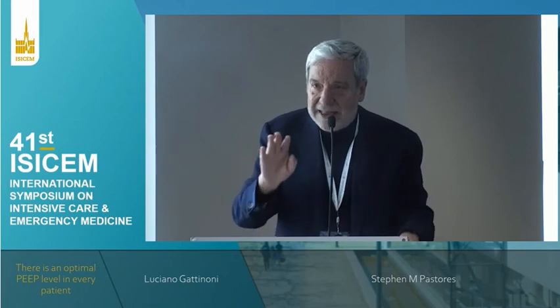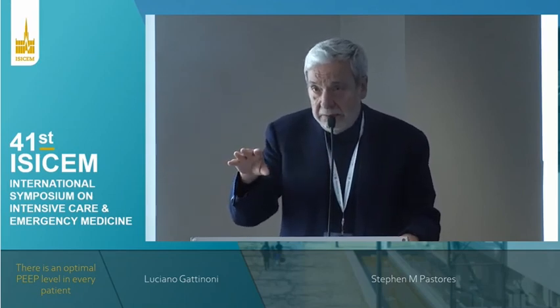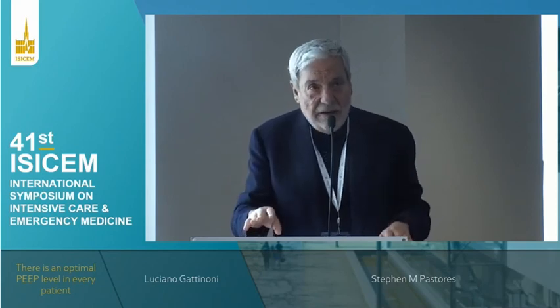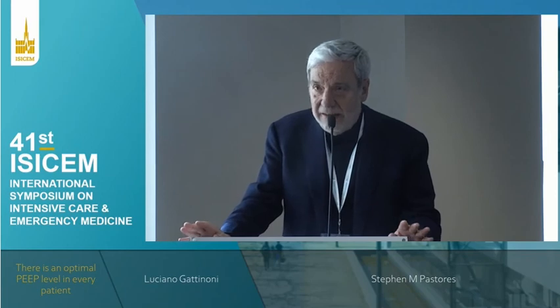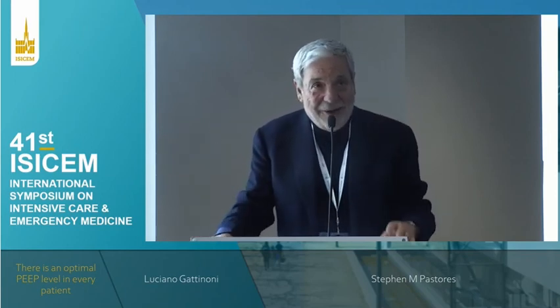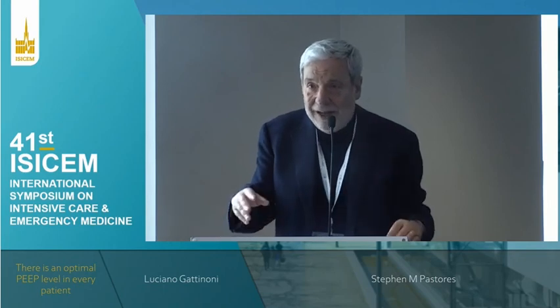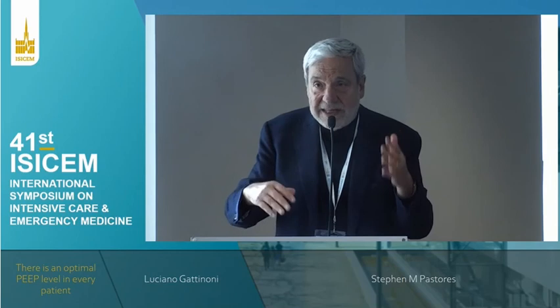And then you decrease the PEEP and you change completely the condition. So please start, I would suggest, around 10, and then sit down, think about the physiology, and wait and see. And at the end of the story, I don't think it will be very different from Amato, something between 7 and 15.